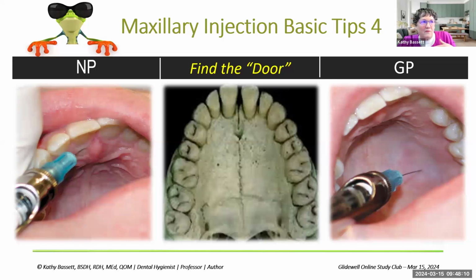So making that 45 degrees, we want to literally make contact with the bone down in here underneath that tissue. So, look and see where you are. And I encourage you to really be at a 45 degrees to go under that rather than very flat, which puts you right into the papilla.